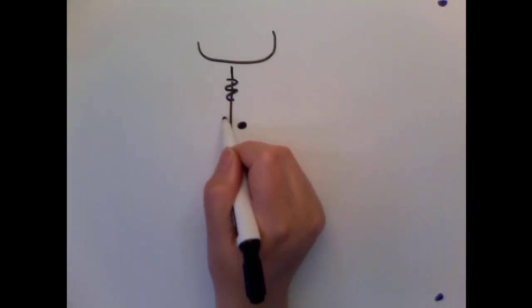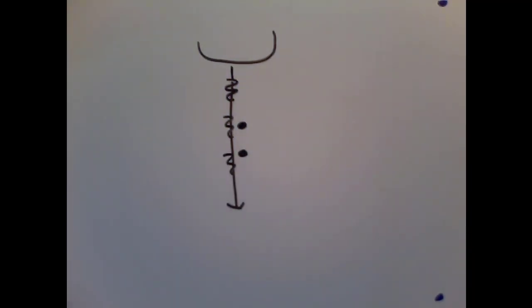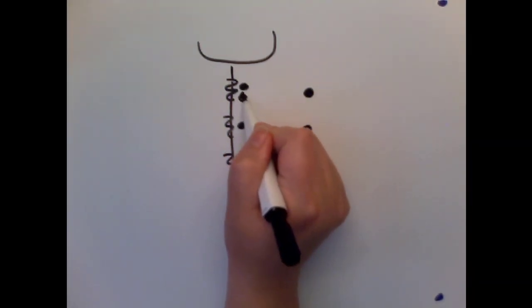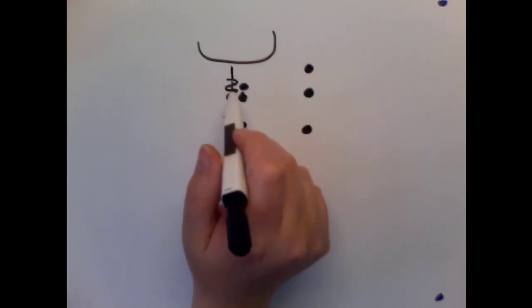So as that pulse comes through, it's going to move down, and if those reflectors are separated by at least one pulse, then you'll get two reflectors on your screen. But if you have two reflectors that sit within one pulse, then only one reflector is reported on the screen. So axial resolution, shorter pulses, gives us a better chance of seeing more detail in our image. Again, we'll talk more about that in detail when we get to it.